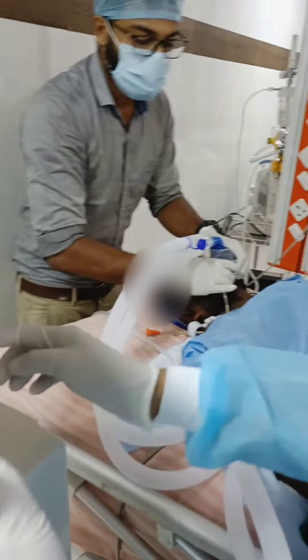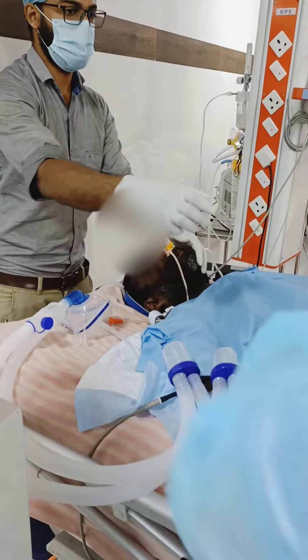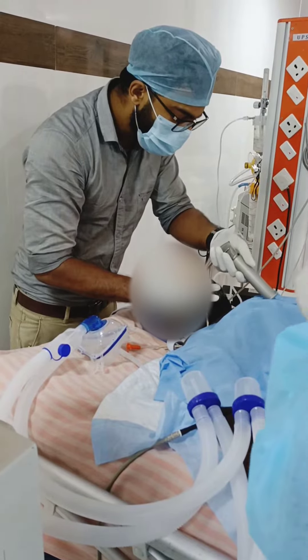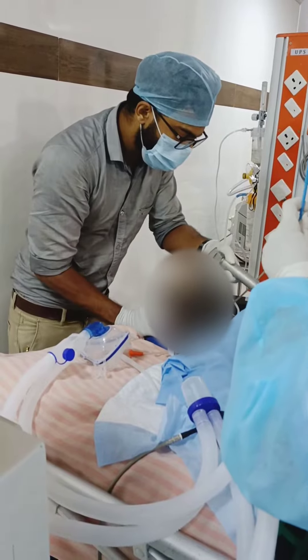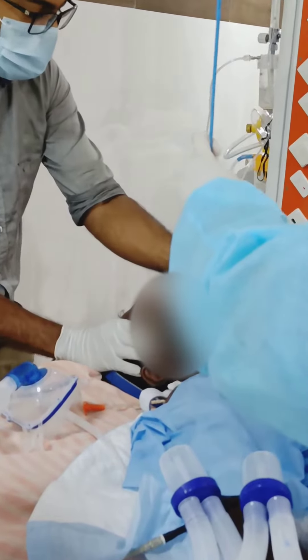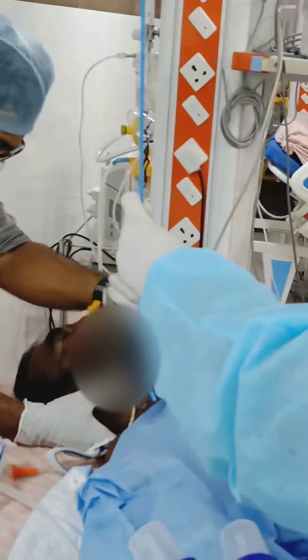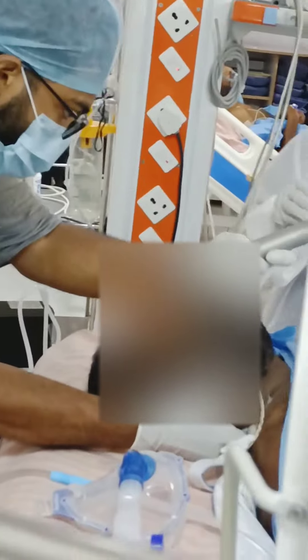Once the patient is paralyzed, I am inserting the laryngoscope, trying to visualize the vocal cord. In this case, the vocal cord is pretty high. It's a difficult kind of intubation — not the regular one.